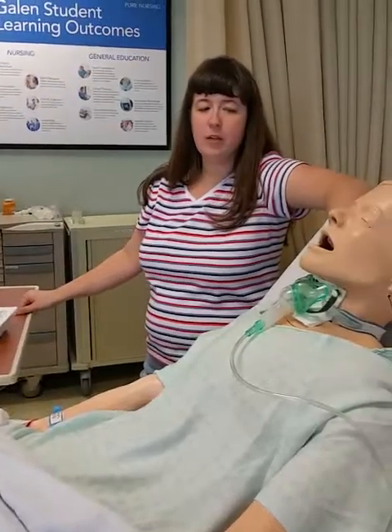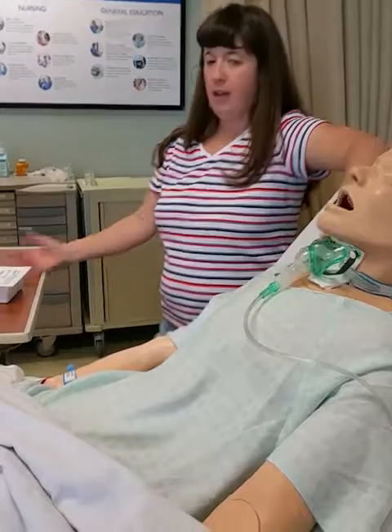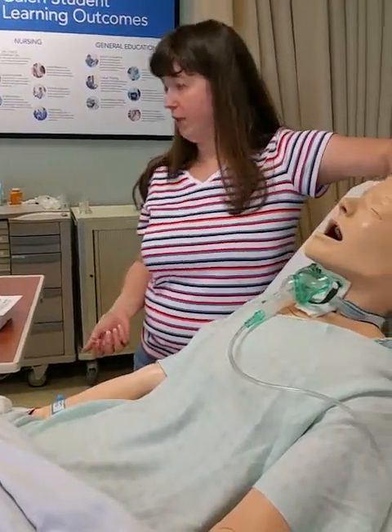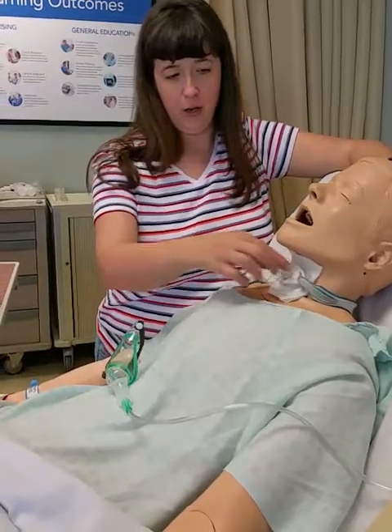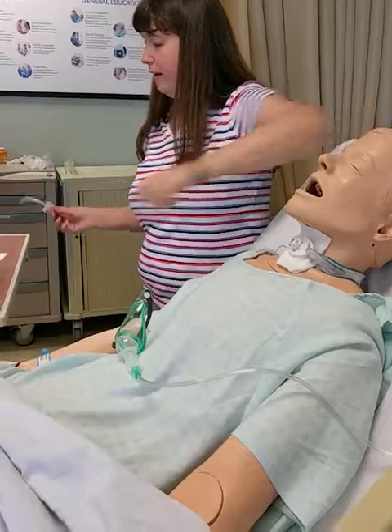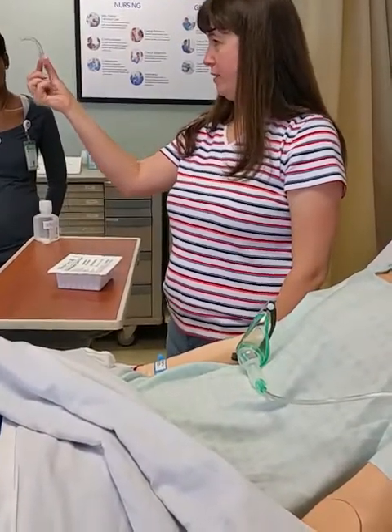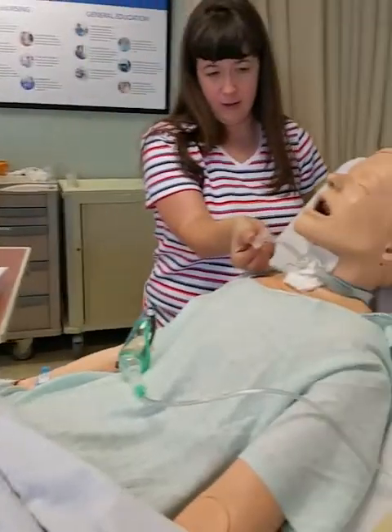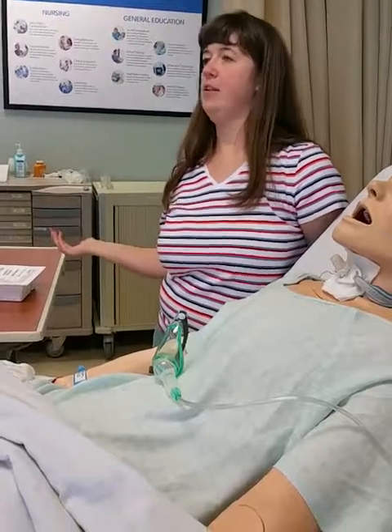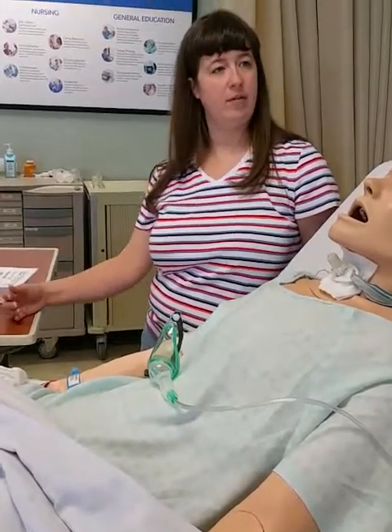The other thing you guys are gonna come across is disposable inner cannulas. If you had a disposable inner cannula, you're gonna put on a regular pair of gloves. You're gonna pop this inner cannula out. You're gonna throw it away. You're gonna have the new sterile one open. You're gonna pick it up by just this piece, because this piece doesn't need to stay sterile. And you're gonna come pop the new inner cannula in. That's an inner cannula change. That's most of what you're probably gonna do in real life.